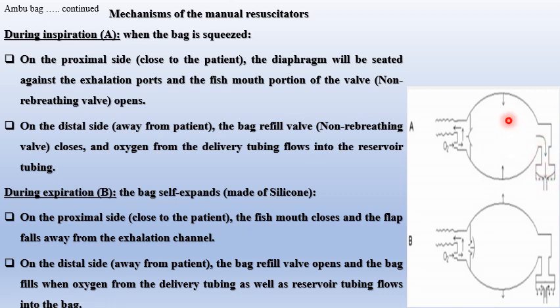At the same time, during inspiration, on the distal side, away from the patient, there is another non-rebreathing valve, which is the bag refill valve. This valve during inspiration closes, and the oxygen from the delivery tubing will flow into the reservoir tubing, so it can be filled.